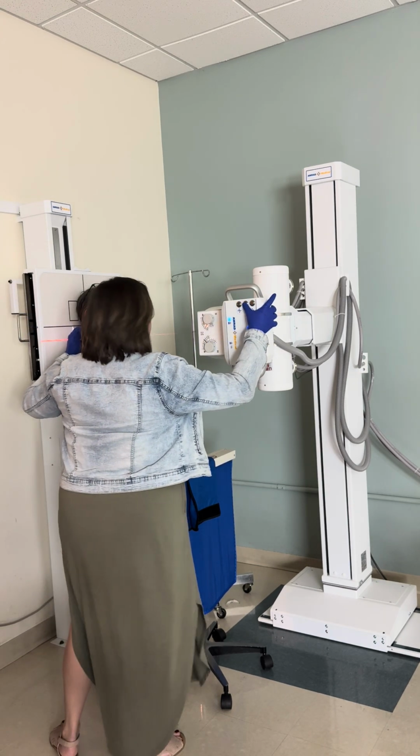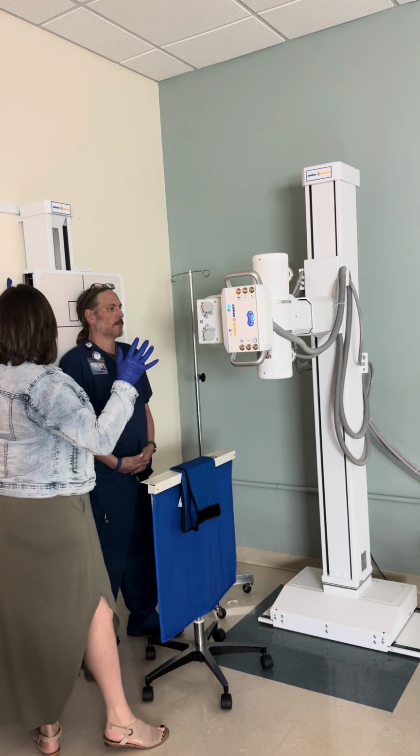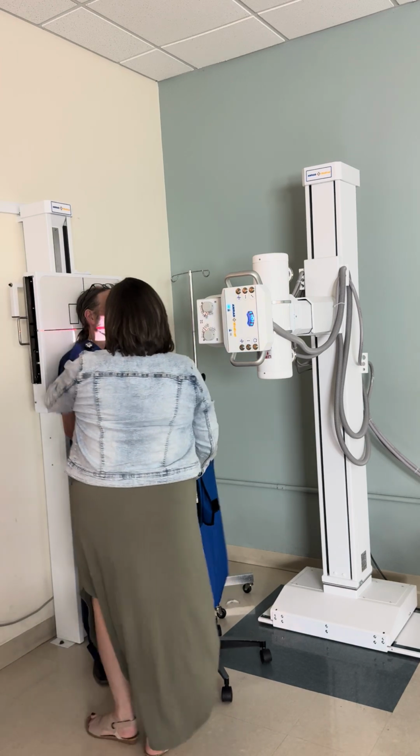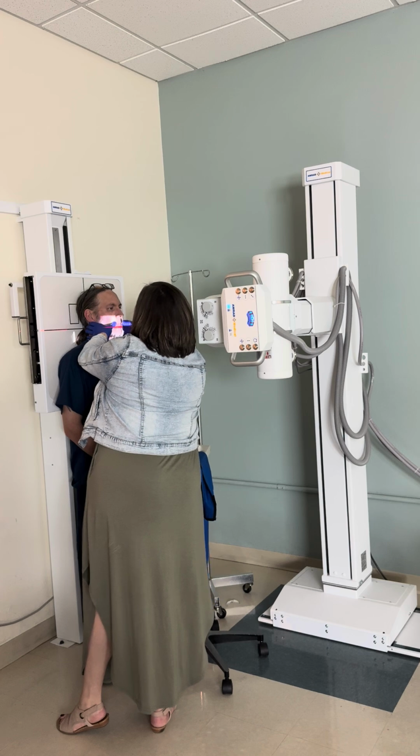So, come a hair higher here. I'm gonna bring this down a smidge. Okay, so I'm gonna go ahead and feel right here behind your ear, and I'm gonna poke here on the front of your mouth. Okay, go ahead and tip your head down a little bit.